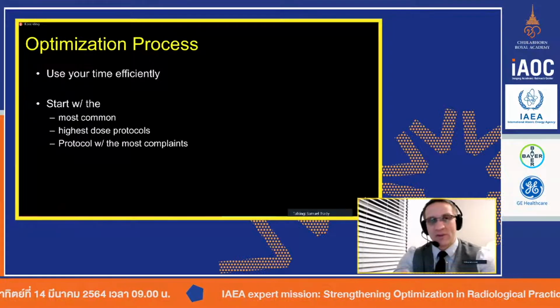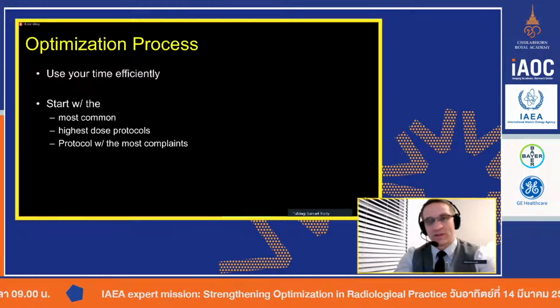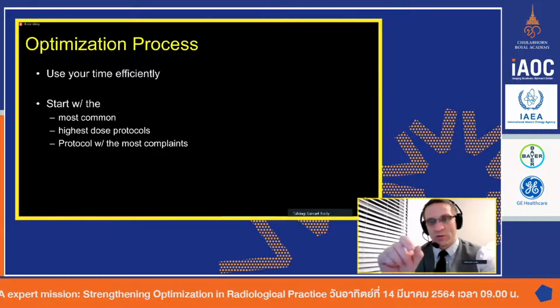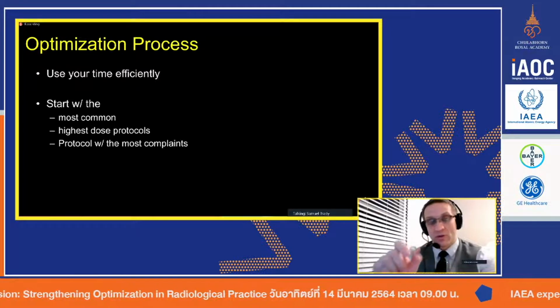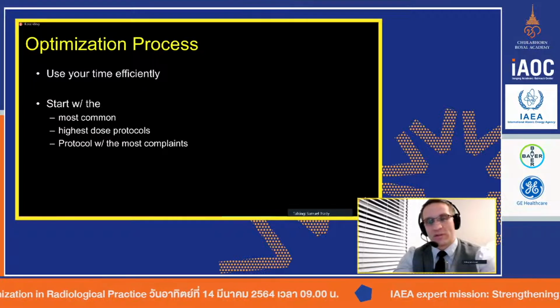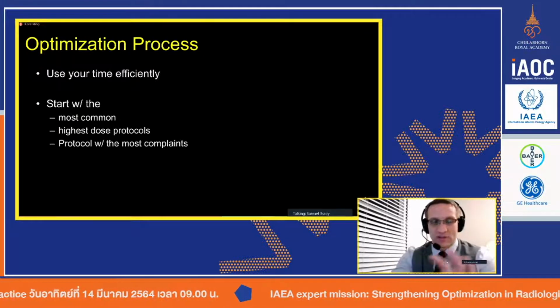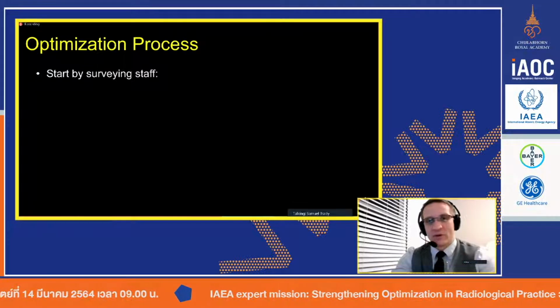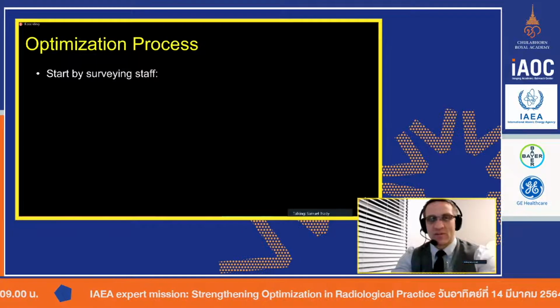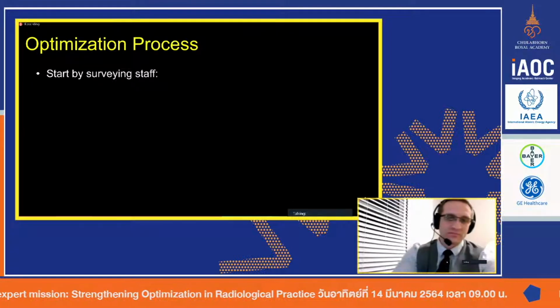If we have multiple radiologists over the course of days, weeks, and months making these comments, you may eventually see trends where certain protocols are not giving the image quality that the radiologists need for their diagnostic confidence. So you can look at the protocols that require the most review because of the comments or complaints that come back to the technologists and the physicists.